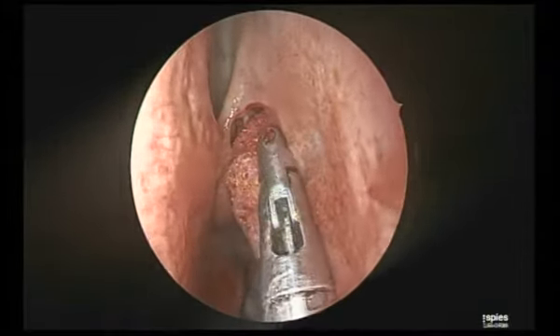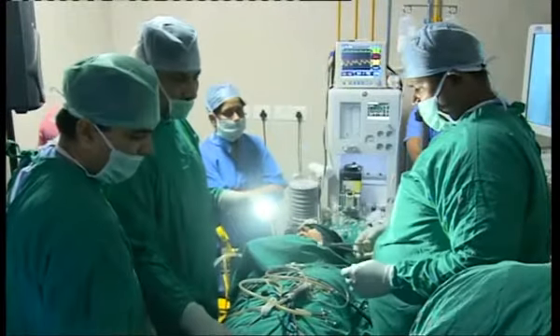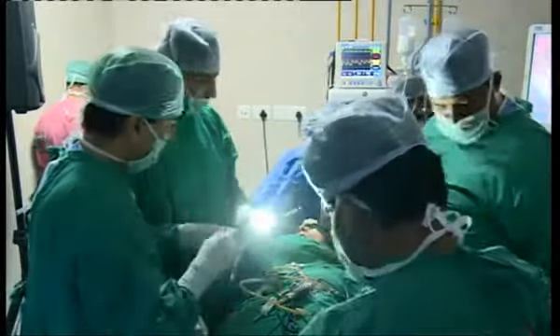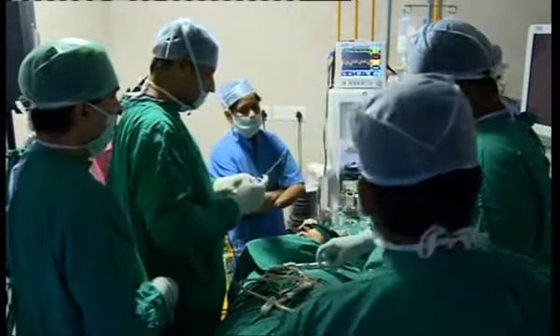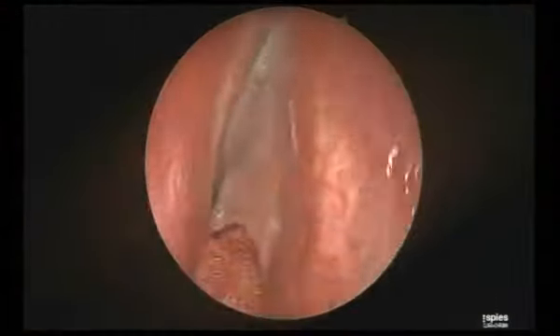And debrider here scores over the other instrument, as it is a sharp cutting instrument. It doesn't peel off. You need to have a good suction backup. Keep the debrider close to the structures, and then you use it gently, and you will never strip off anything. So that's what we want: a complete mucosal lining in the sinus cavity, so that the mucociliary activity can come back.